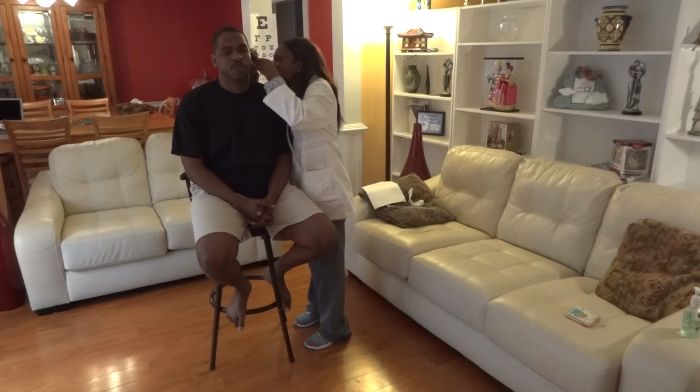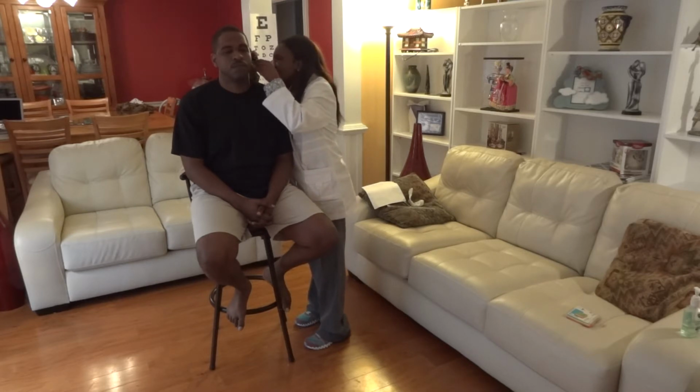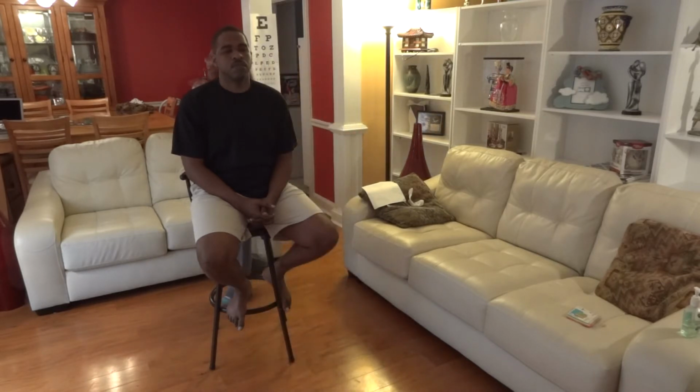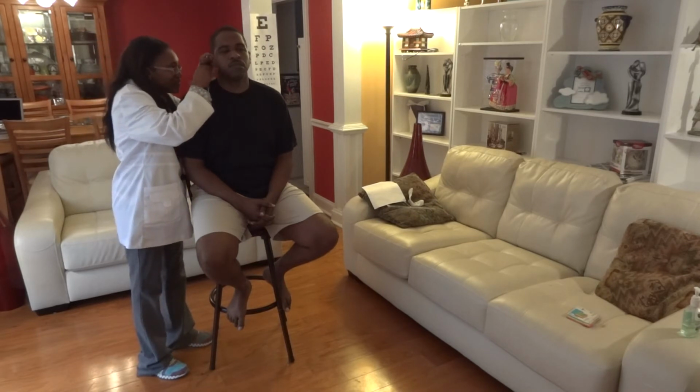And what you're looking for, a moderate amount of cerumen is not abnormal. That is within normal limits. It's not too much, and I am able to see the tympanic membrane, which is a pearly gray. It's not bulging. It doesn't appear to be ruptured. This is consistent because the patient has not been complaining of any ear pain.